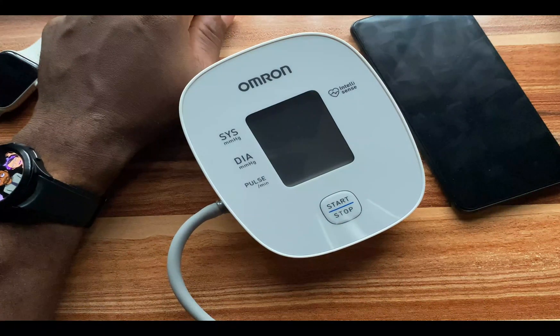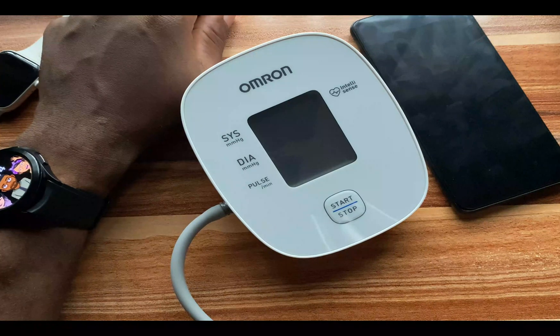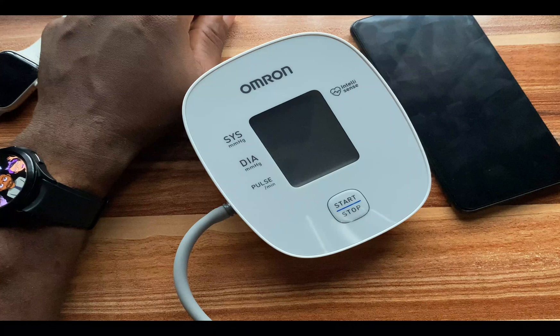Hello everyone, this is Judy and welcome to the Smartwatch Series. In this video I'm going to show you how to calibrate the blood pressure measurement of the Galaxy Watch 4 so that you can get the best possible blood pressure measurement.